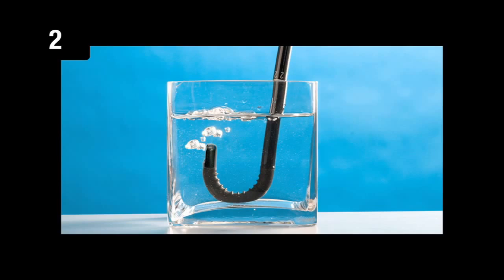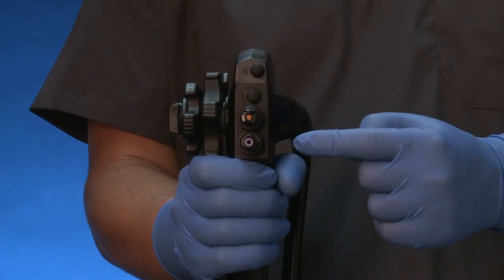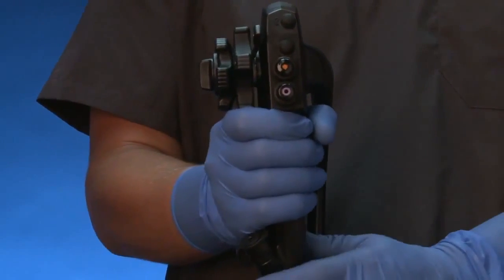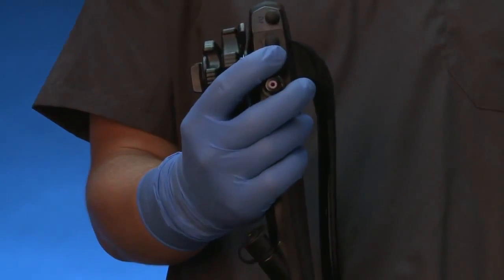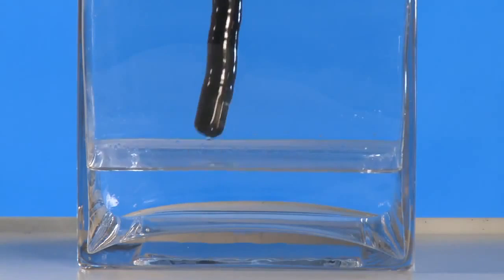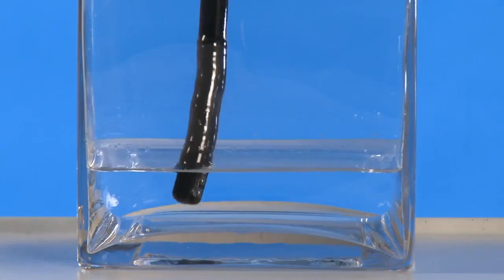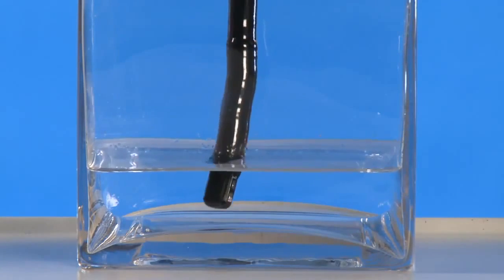Step 2. Pre-clean the channels. Holding down and releasing the suction valve button, alternately draw air and diluted enzymatic solution into the suction channel by dipping the distal tip in and out of the solution. Observe the suction tubing at the PVE connector until fluid runs clear.